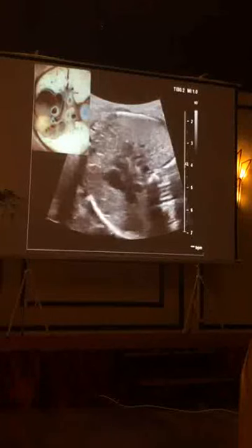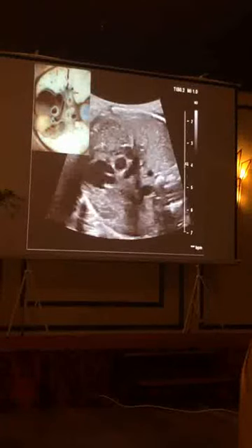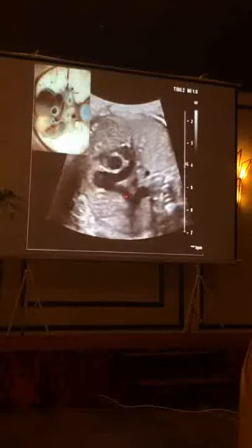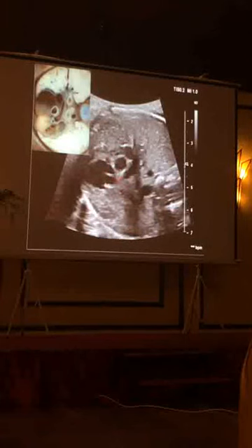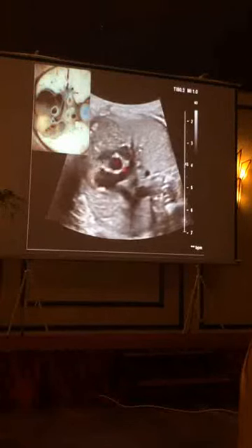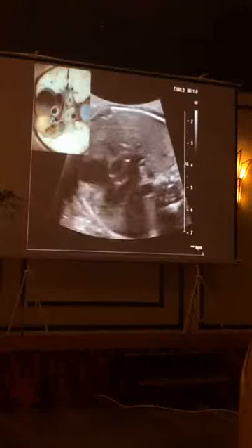Now we are moving down a bit and more horizontally, and you can see this kind of view where the pulmonary trunk branches, and you can see the branches of the pulmonary trunk with the right pulmonary artery behind the aorta and the SVC.